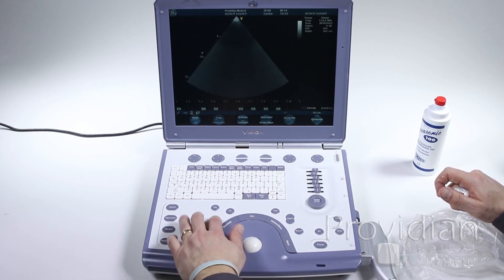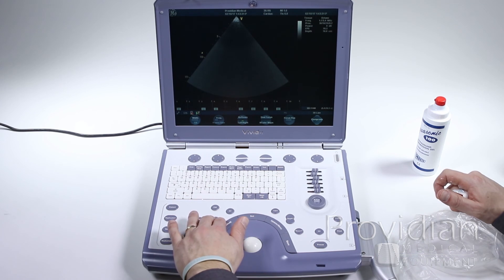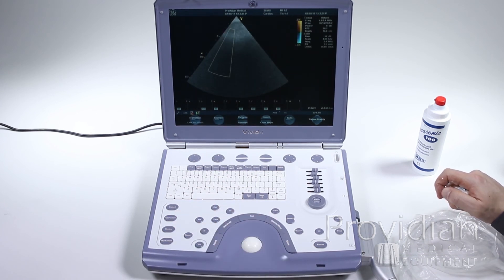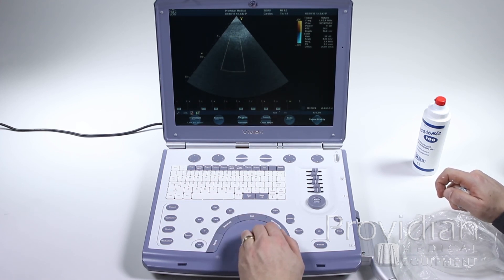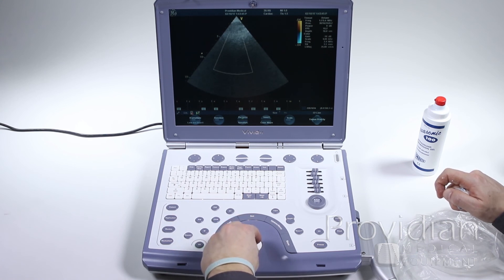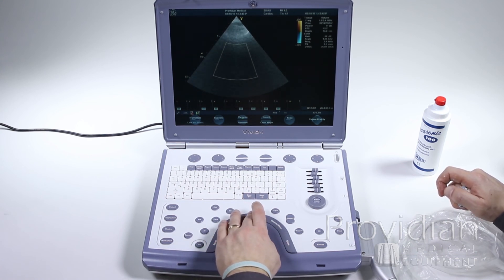And color flow works, again, pretty much all the same way. You have your color box. I'm going to press set to change the size or the position of that color box.